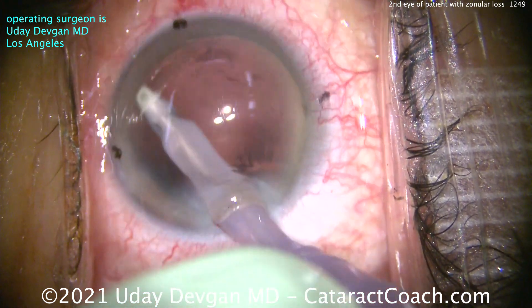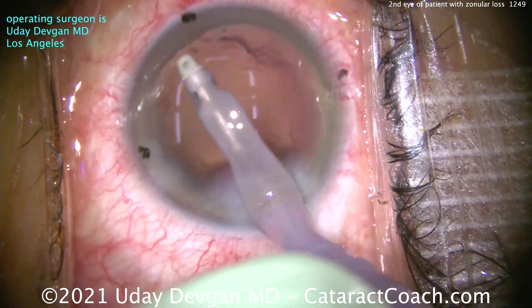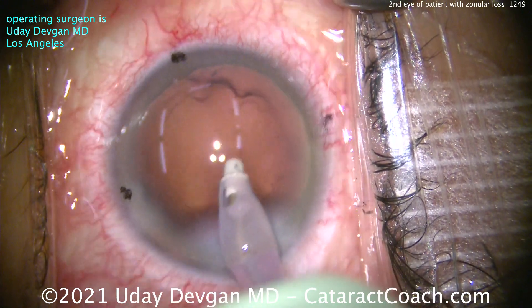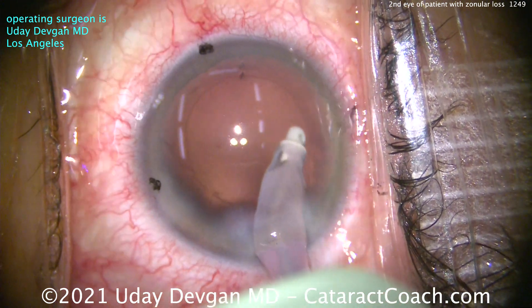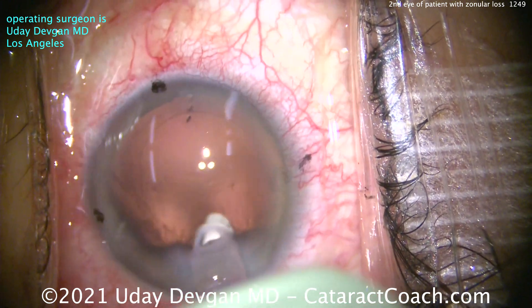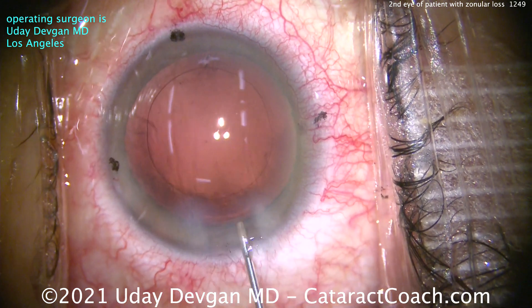On the first eye — yesterday's video 1248 — you saw 3 to 4 clock hours of zonular loss and absence. Very tough. I had to put a CTR in, really take our time. We avoided vitreous prolapse, kept the anterior hyaloid face intact, got the lens at the correct toric axis, and the EDOF focusing element was beautifully centered in the central Purkinje images in the visual axis. But it was a lot of work. In this case, it's going to be a lot easier.